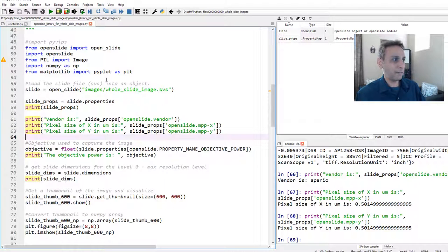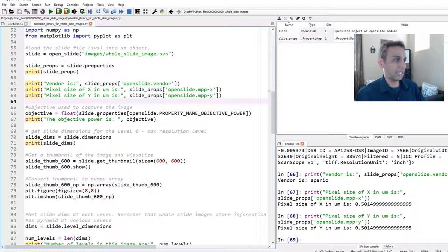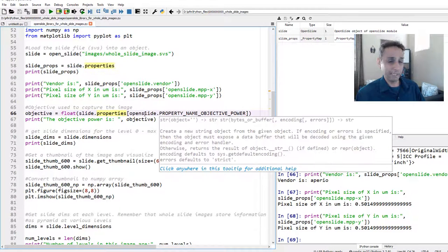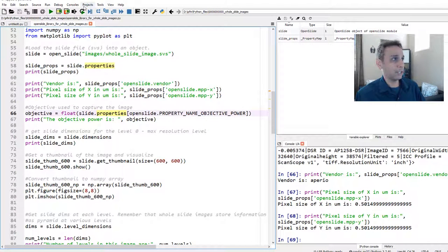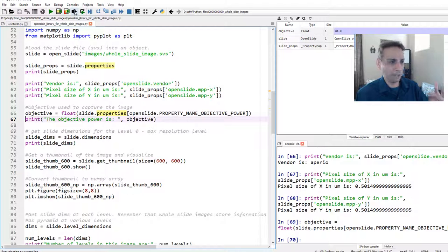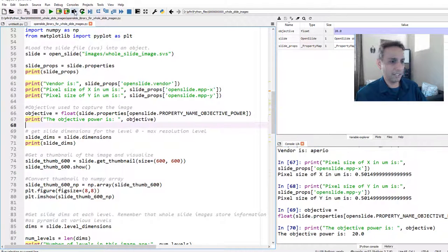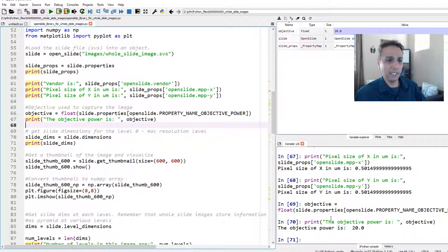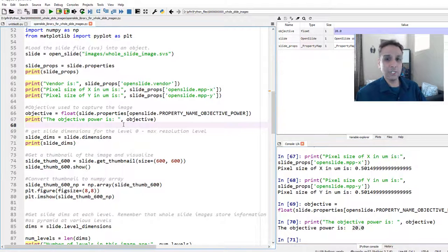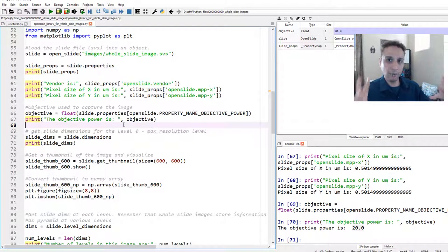Let's also get the objective power from properties. We can see it's 20x — meaning the entire slide was collected at 20x magnification. From properties alone you can extract a lot of useful metadata about your slide.